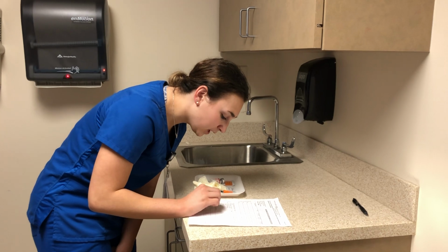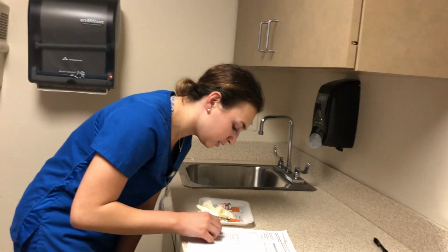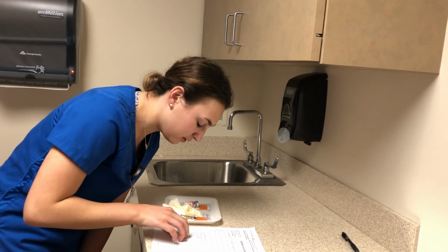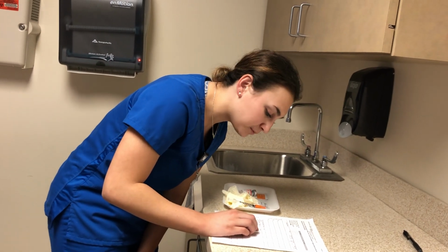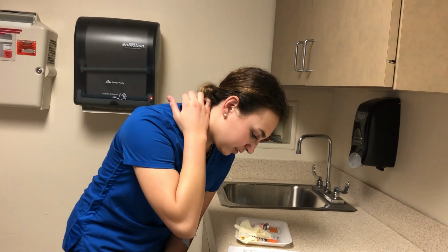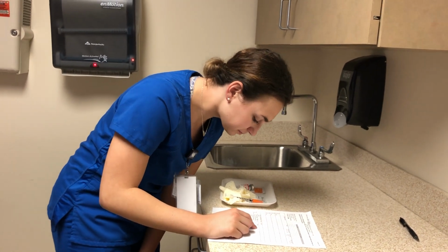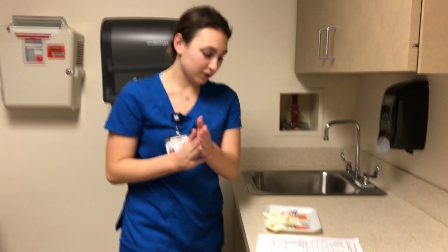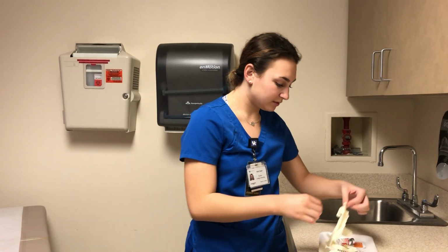And I'm giving 6 units because my patient's blood sugar is 258, which is in the range of 251 to 300, which is what my MAR tells me to give. I am administering this subcutaneously to the abdomen. It is 11 o'clock in the morning. My patient has not had any previous injections on this 24-hour MAR, so it is safe to administer. So now I'm going to wash my hands and put on my gloves.